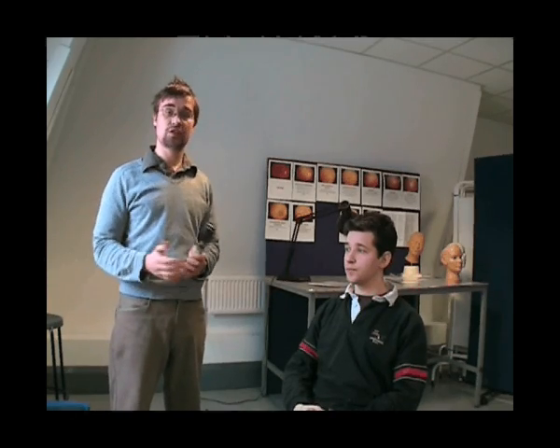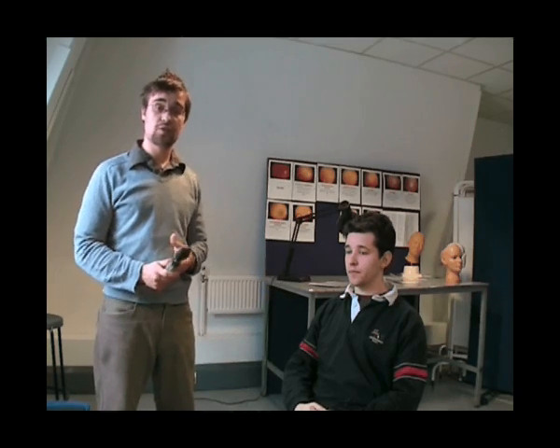Before we start this technique, there are still two things that we need to consider. The first thing is dimming the lights. Ideally, you'd like to perform this in a dimly lit room, but obviously for the purposes of video, we can't. You may also consider using eye drops to dilate the pupils. You'd only do this with informed consent from the patient, and you would definitely need supervision as a medical student.